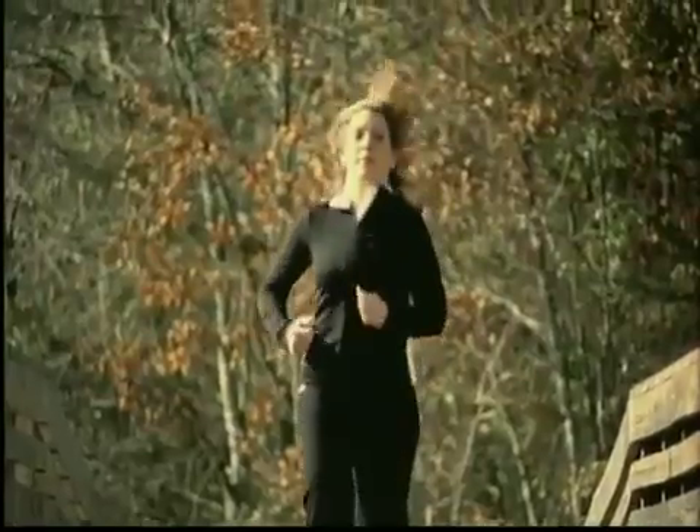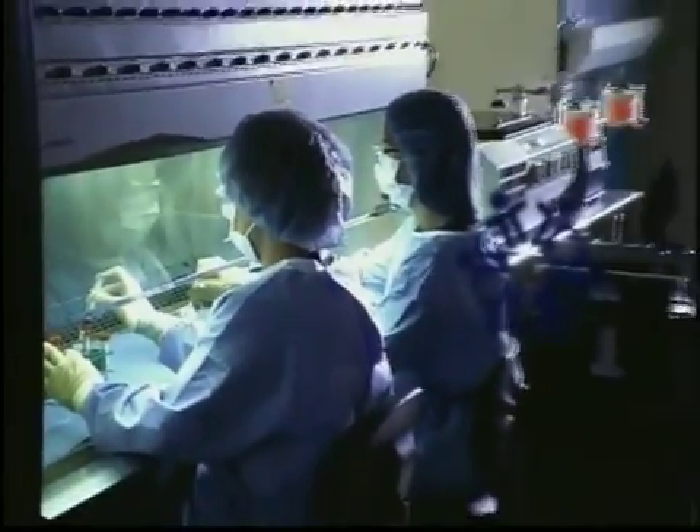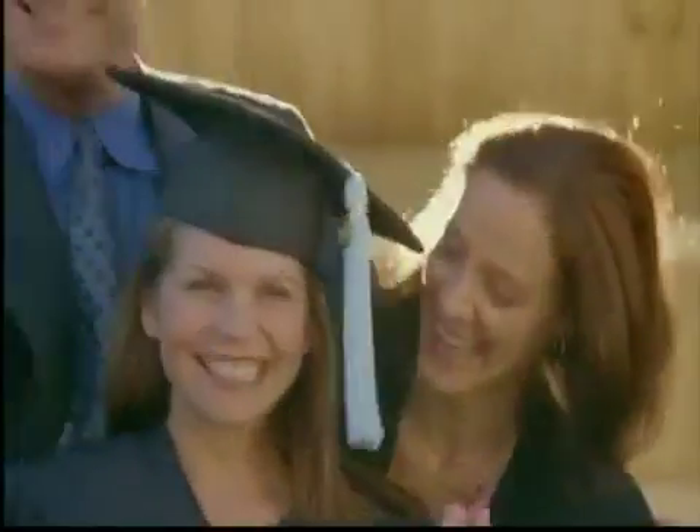We test the products to see how well they work before they go into people, and more importantly, we test the products after they go into people. The rinse recovery process vigorously agitates the tissue and allows us to get a thorough analysis of what is growing on that tissue. At the end of the day, if I do not feel comfortable with that tissue being implanted in a member of my own family, I will not allow it to be released.